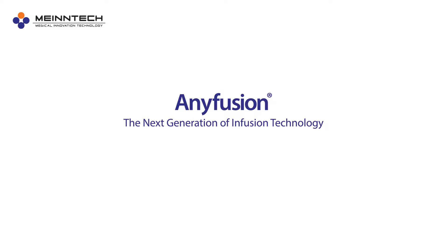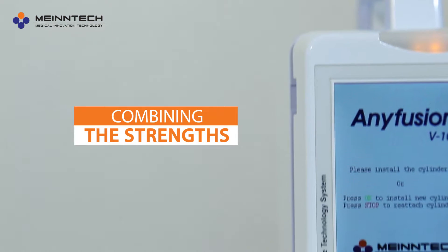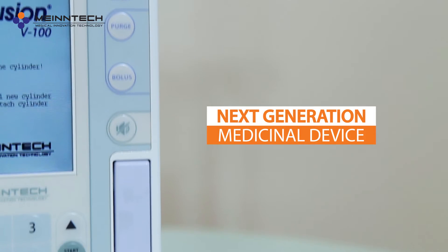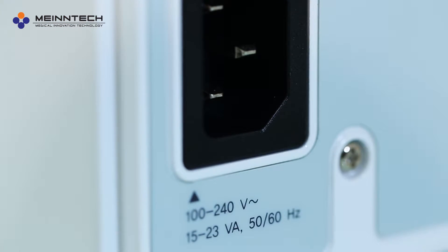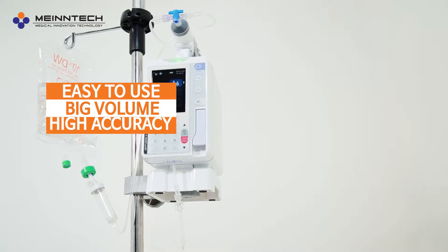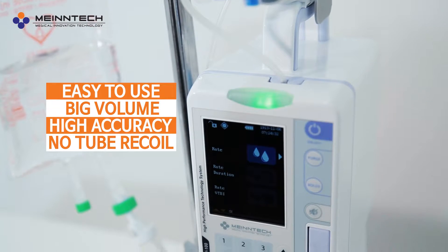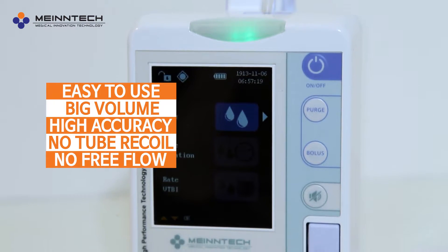Anyfusion — the next generation of infusion technology. Anyfusion solves the two previous pump styles by combining the strengths of both, a truly innovative next-generation medical fluid pumping device. Its simple and controlled design, high accuracy, and no tube recoil makes it a safe infusion pump without free flow.